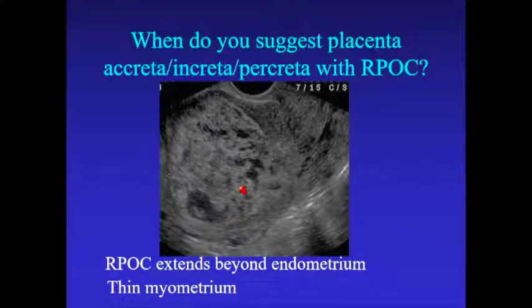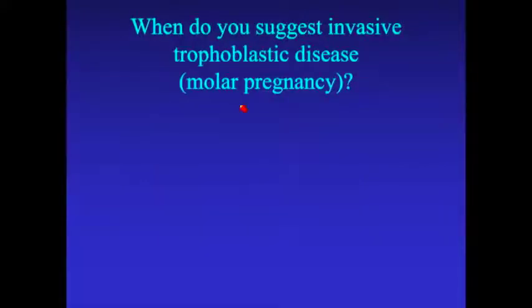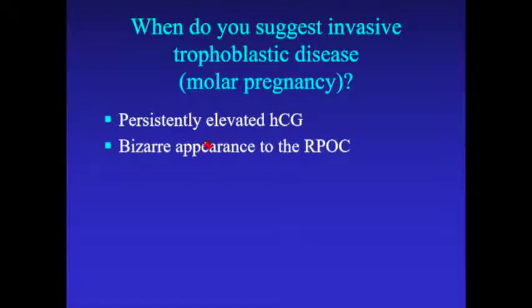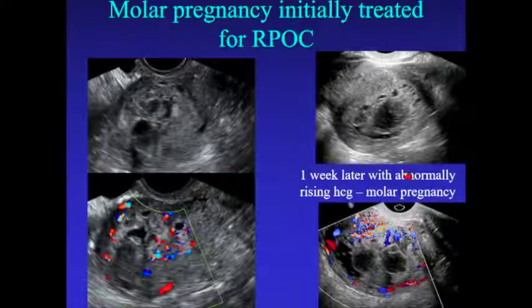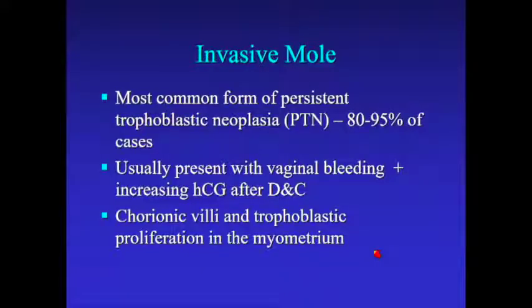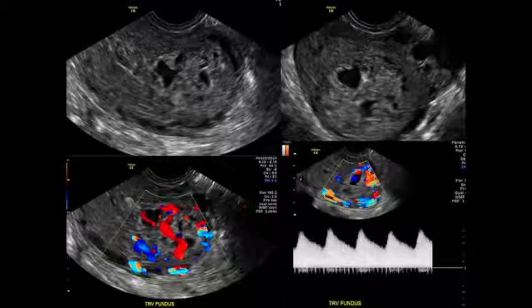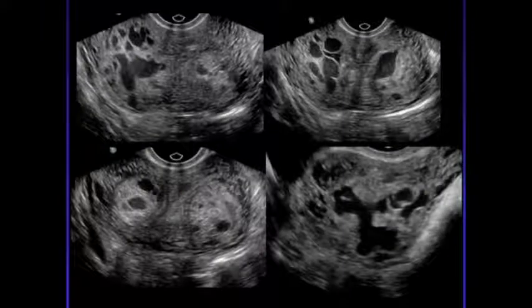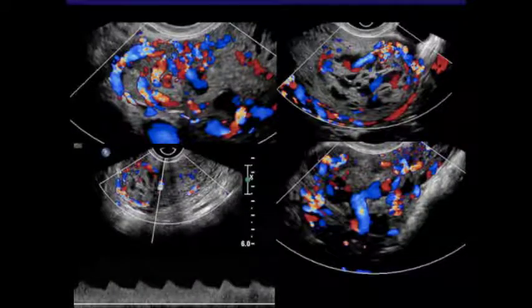On placenta accreta: mention it when you see thin myometrium. For invasive trophoblastic disease or molar pregnancy, we're not very good at this — it's a patient with a bizarre appearance to the retained products and a persistently elevated beta-HCG. You can see very heterogeneous material after a D&C with lots of abnormal blood flow. Invasive moles are the most common type of persistent trophoblastic neoplasia, and we usually see this incidentally after a D&C. These cases appear very heterogeneous, very abnormal, and very vascular.